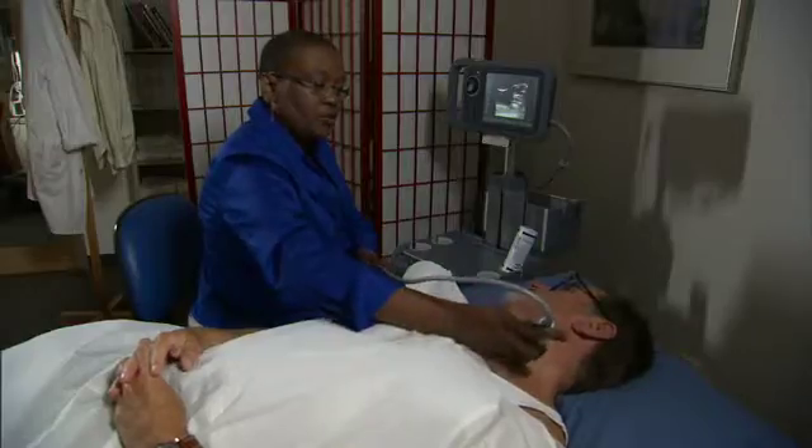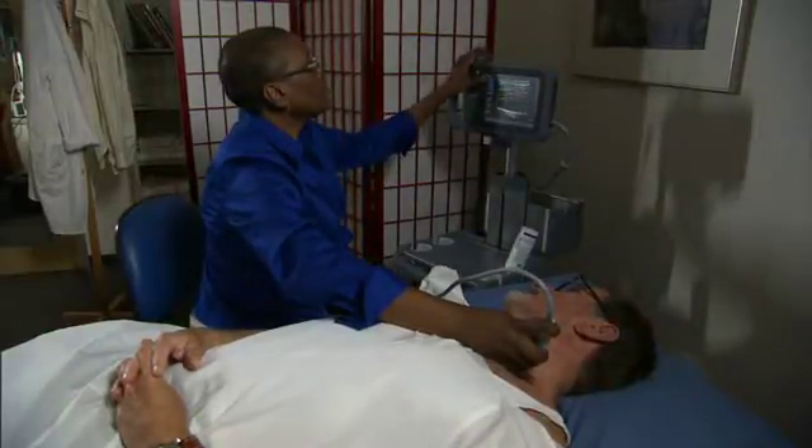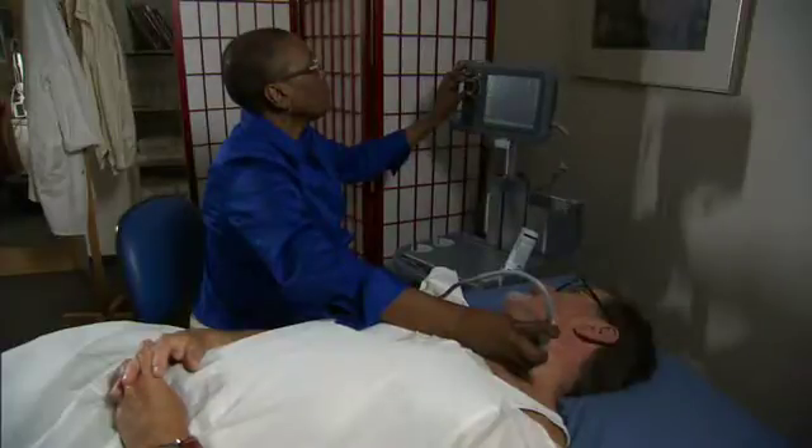I like the new NanoMax. I like the look of it. I like the size of it. I think that I'm excited to try using it. I think it will be a neat tool in our clinical exam rooms.